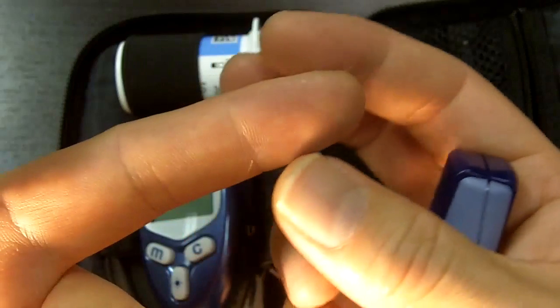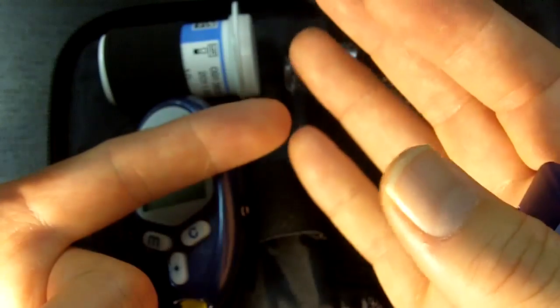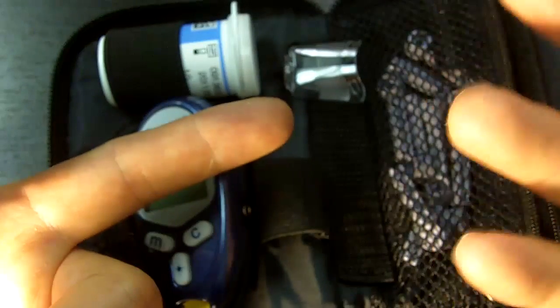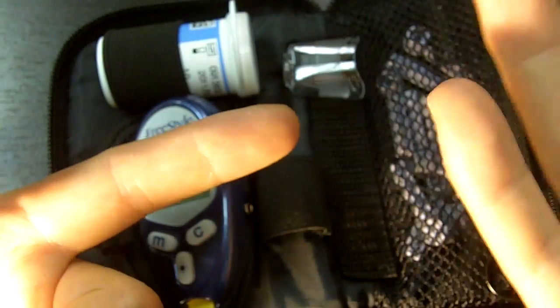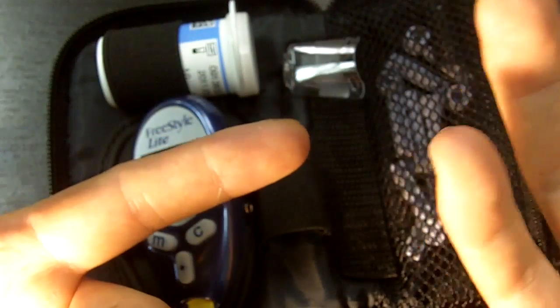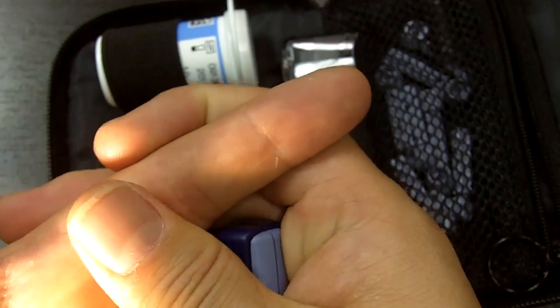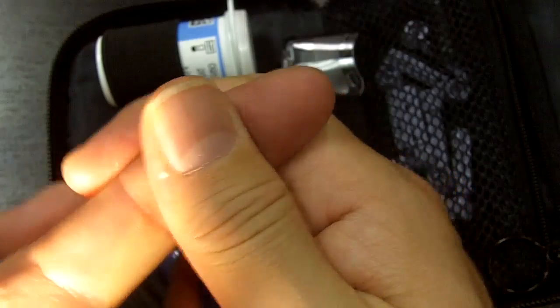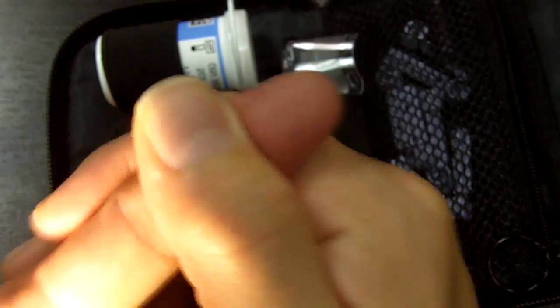If you have circulation problems, keep your fingers below your heart — that's the first thing. That way your heart is helping push out the blood. Also, if you wash your hands, wash them in some warm water, as that will increase circulation as well. The easiest way is just to go from the back to the front, and then press — you don't want to milk it aggressively.